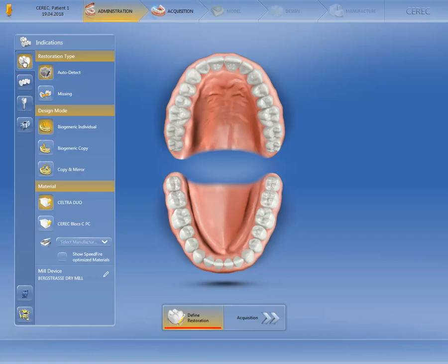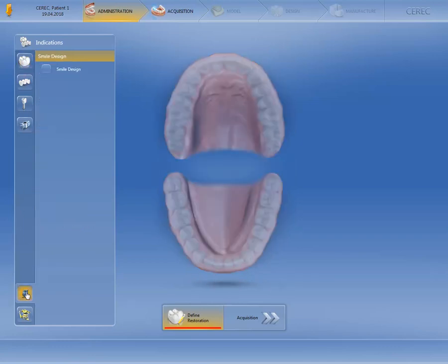Additionally, you will find the Smile Design function on the lower edge of the screen. Let's click on this option to take a better look. In order to continue with the Smile Design function, activate the checkbox provided for it.